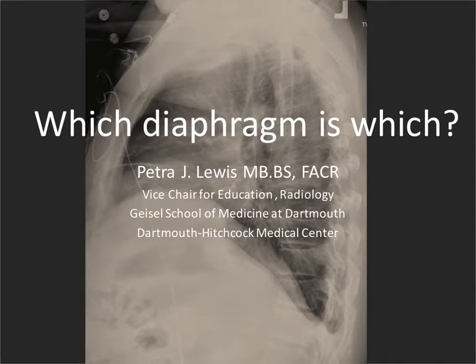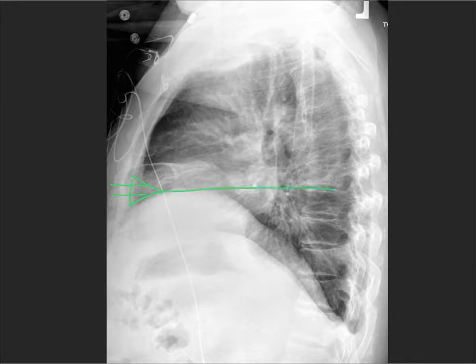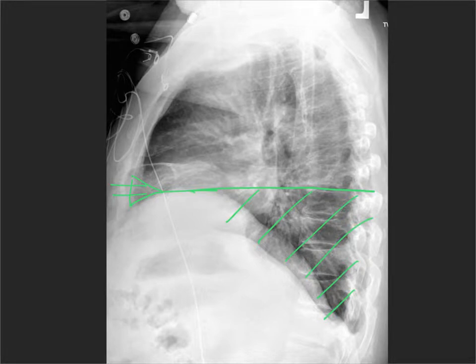I'm going to show you how you can tell in most patients which hemidiaphragm is which in the lateral chest x-ray. The x-ray beam on a frontal radiograph comes straight through, and any lung that is below the level of the hemidiaphragm is going to be hidden — a big area behind the hemidiaphragm — and your only hope of seeing it is on the lateral chest radiograph.